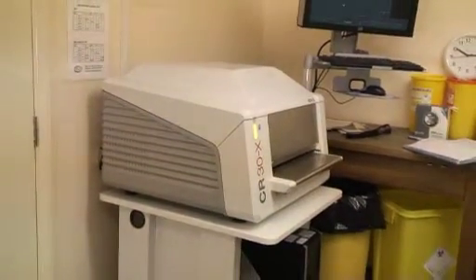And it's better from an image storage perspective as well. So the old-fashioned way of storing them in boxes around the place is replaced by everything being stored on a database, so it's easier to access. And environmentally it's much better because we haven't got all those chemicals and health and safety issues and those types of things as well. So lots of advantages to it, definitely.